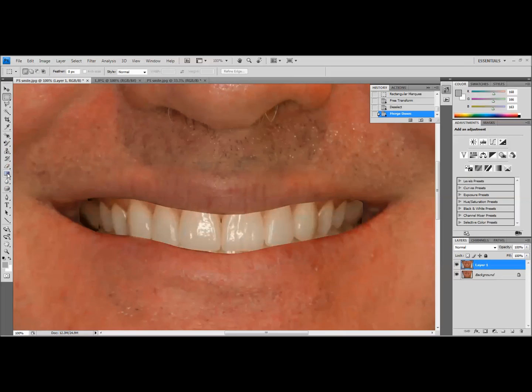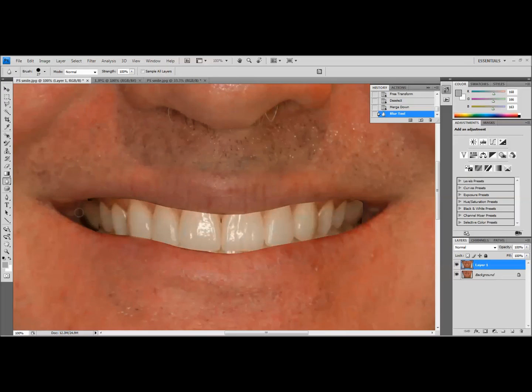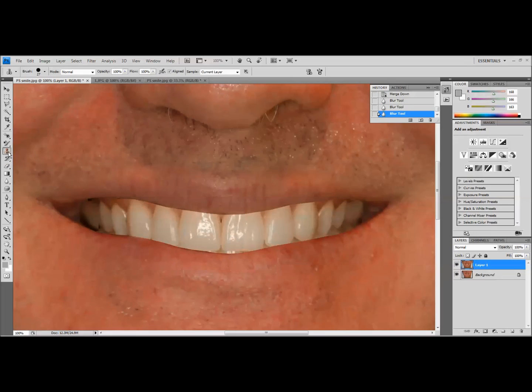So to clean this up, you could either use the clone stamp tool or I'm going to start out by just using the blur tool and I'm going to blur in some of this. You might have to adjust the brush hardness to make it a little bit more aggressive. Blur that a bit.